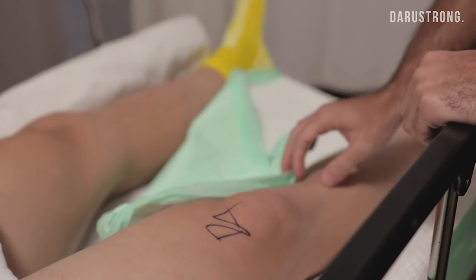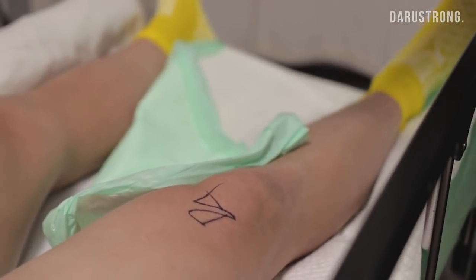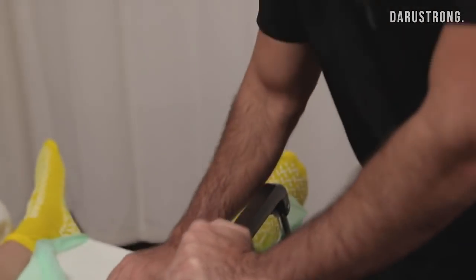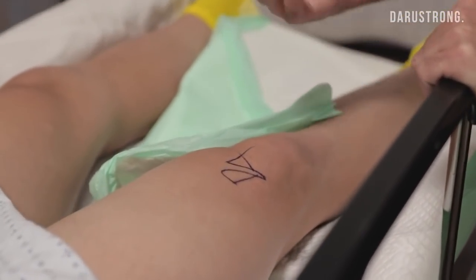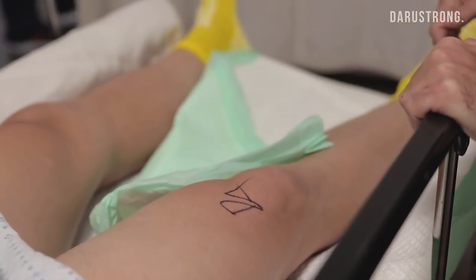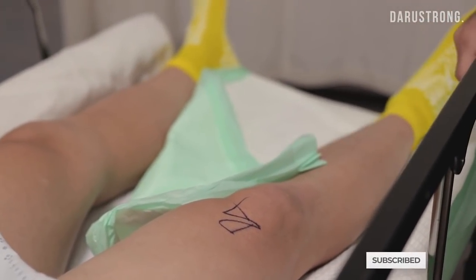We're going to harvest a central third of the patellar tendon with a bone plug on the patella and on the tip. You're going to be asleep for all this, so we're not torturing you. That is going to become your new ACL during the reconstruction. So you'll have an incision here where I take that out, a little incision here where we pass it up through the tibia, in through the knee arthroscopically and seat it into the femur side. Then you'll have two little poke holes here where I'm doing the arthroscopic work.